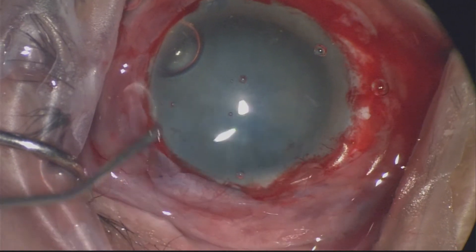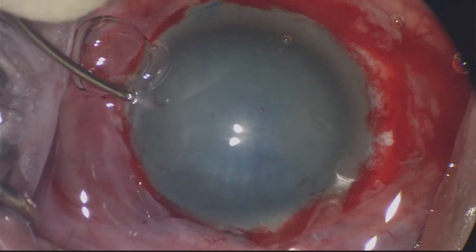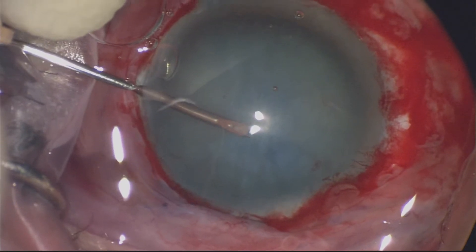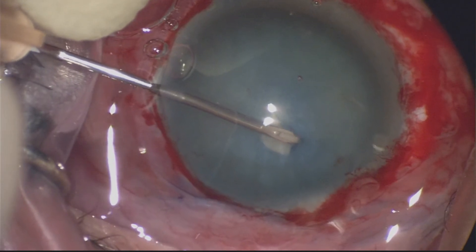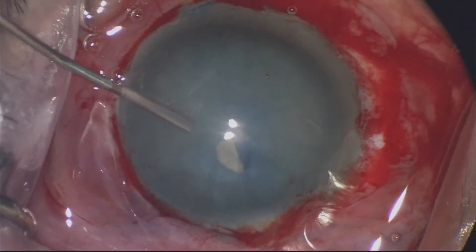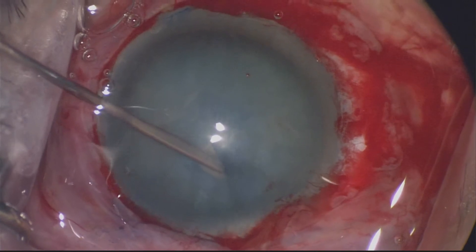Here I'm putting some HPMC drops to coat the surface. HPMC is crucial in these situations — you want to maximise your view and stop the cornea from becoming dry and edematous, so you keep topping it up. I'm observing the capsule behaviour with the Vision Blue, just trying to make a curve upwards, and then I decompress by aspirating some of the soft lens matter using an HPMC cannula on a syringe.